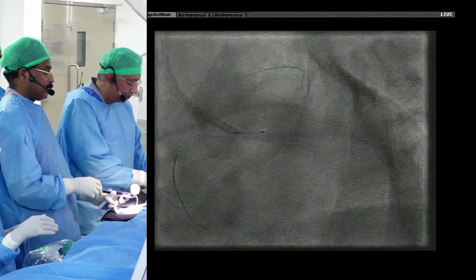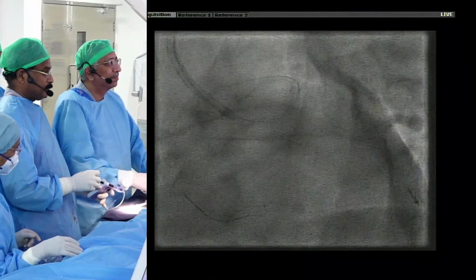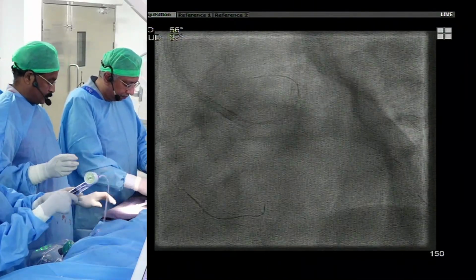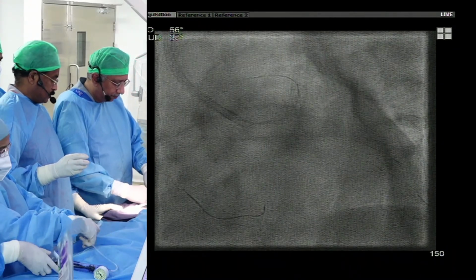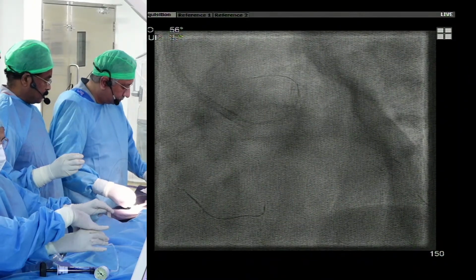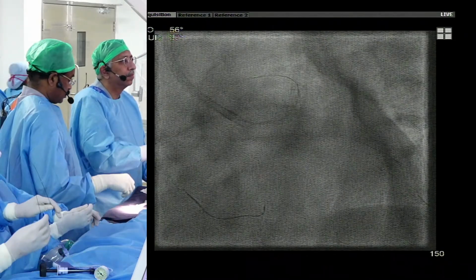Oh, great. So Ronnie, while you were working, we were talking about your excellent work on the left main OCT and seeing what happens to the side branch without a kiss. So can you highlight some of the features of that work for us? Because it's very interesting. Dr. Latif just asked whether or not we should mandatory kiss.